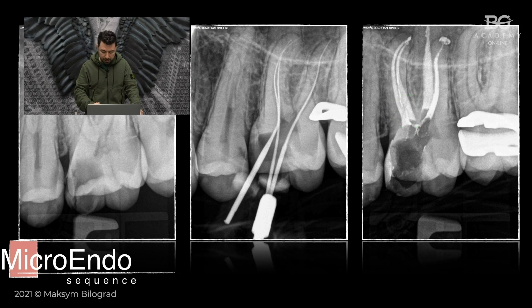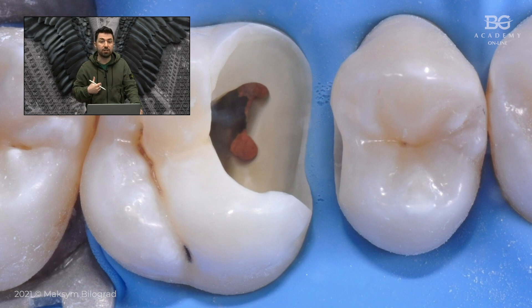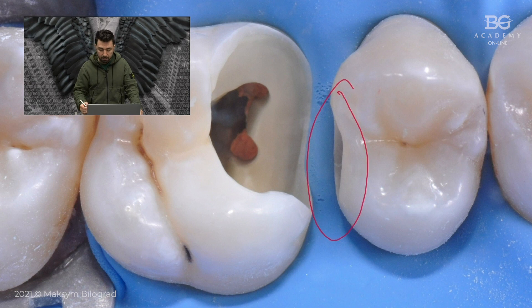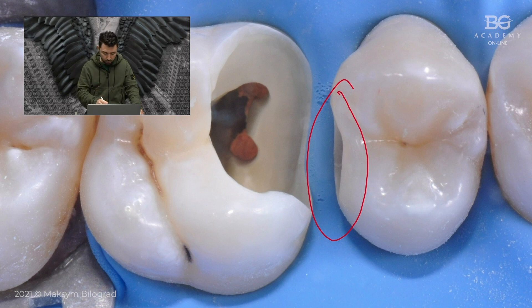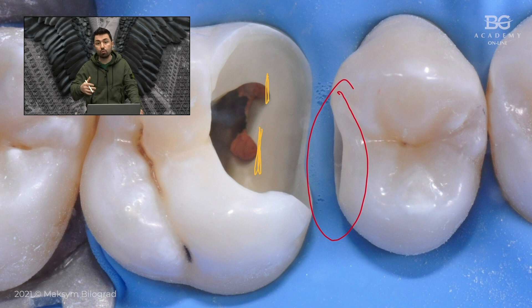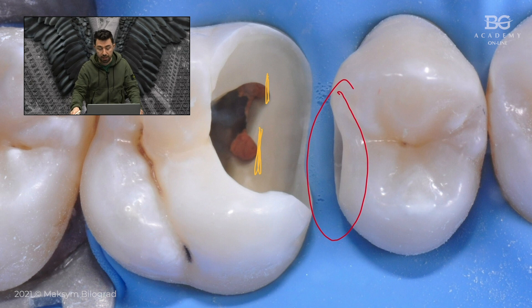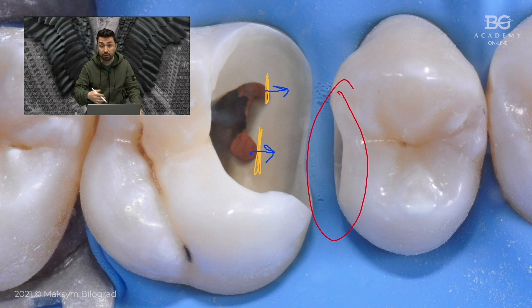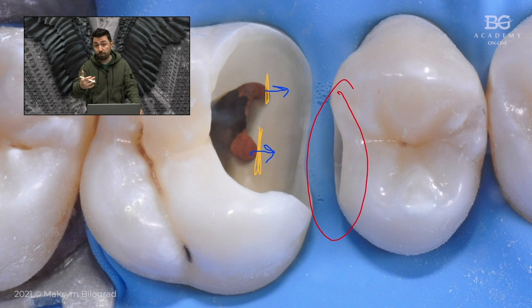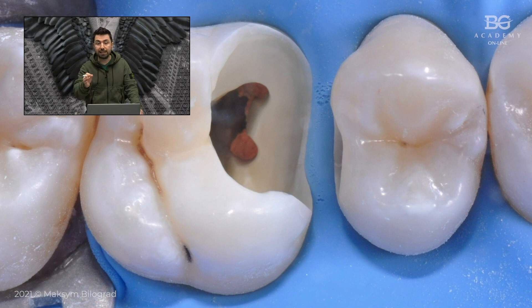The reason why it happened — let me go back to previous slides so you will be able to see — is that the access to the mesial system was not correct. In fact, my file had complete contact with the mesial walls. When my instrument was inserted into the root canal, it met resistance from the mesial aspect of the orifice. In that case, you have to move your orifice more mesially, using an ultrasonic tip or a thin special endodontic burr, to allow the file to reach the root canal freely into the middle third.